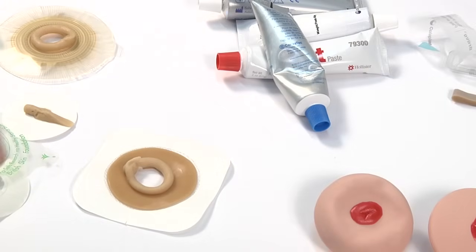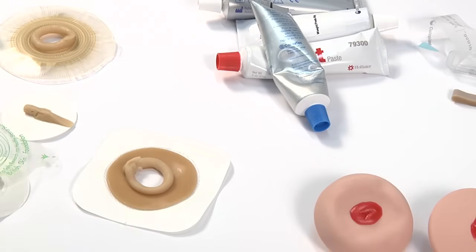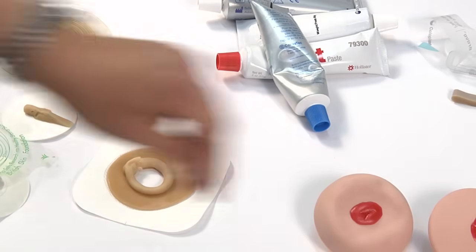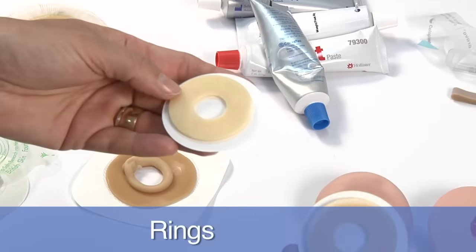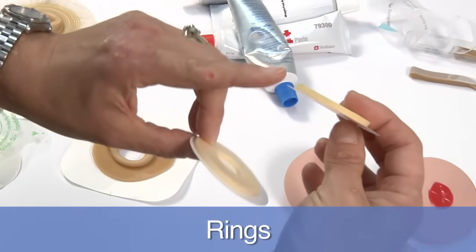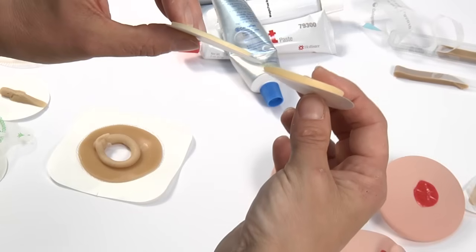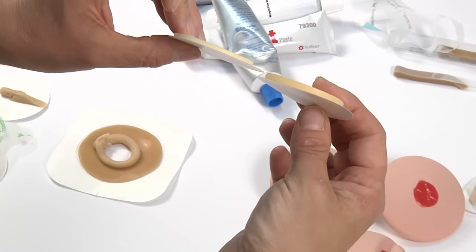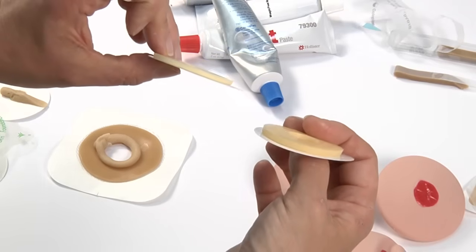The next grouping are rings, and that's probably the largest grouping out of all of them, and they have a broad range of shapes and sizes that are available to you. Again, they don't have any alcohol in them, and they come preformed. The most commonly used or recognized ones are these round ones, although what we're starting to see now is that they come in what we call a regular thickness, and then these are called the slims, and a couple of the companies have now got availability in a slim version. Eakin and Coloplast have thin versions of it.